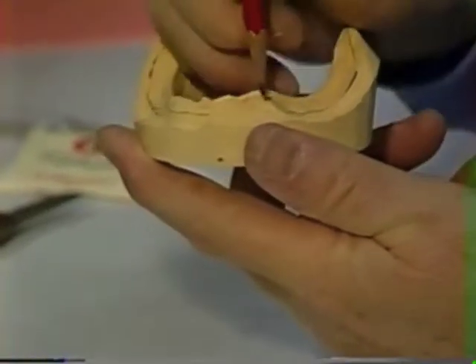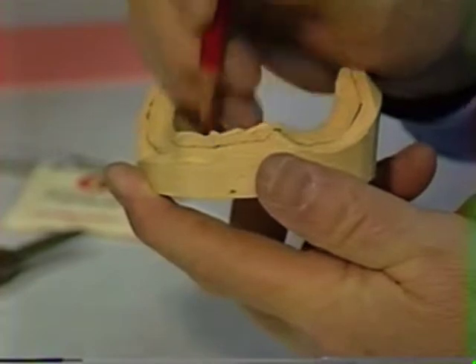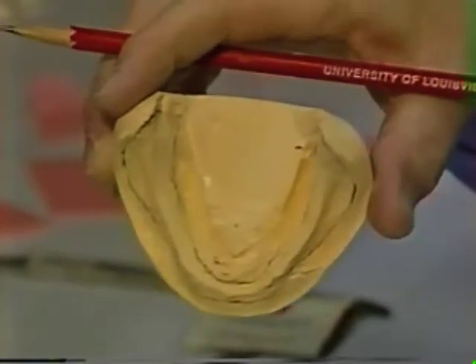It'll be right at that height. Then after the notch, we can drop it back down and follow the mucolabial fold around to meet the other side. That is the outline, basically, of what we want our tray to look like.